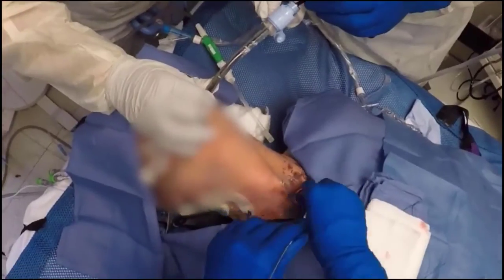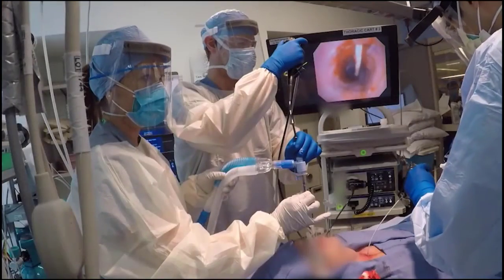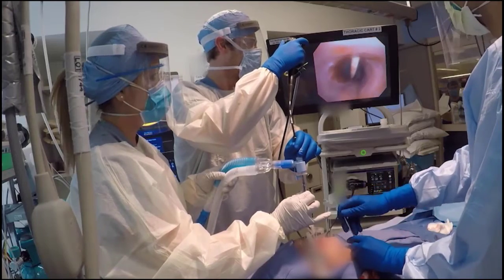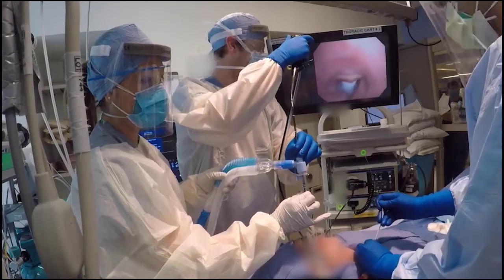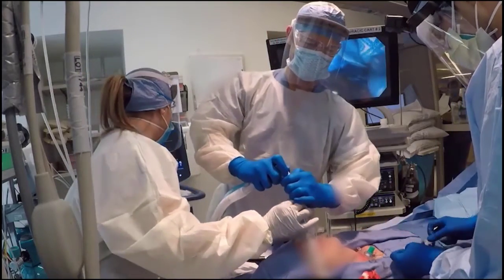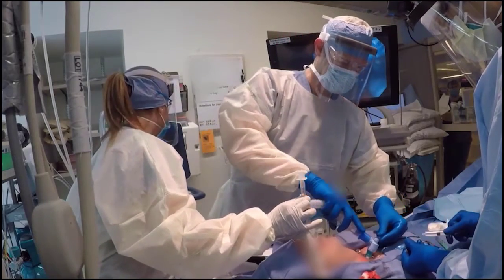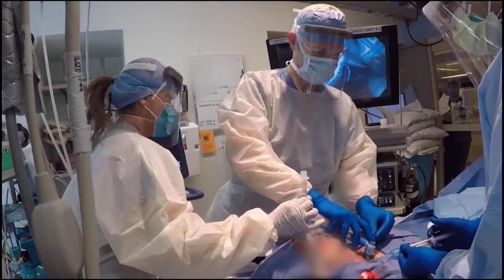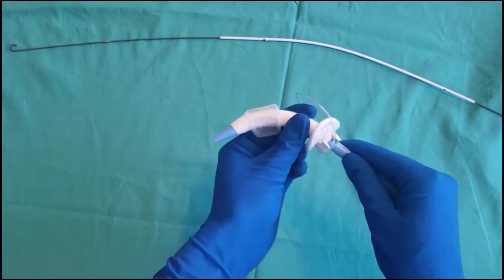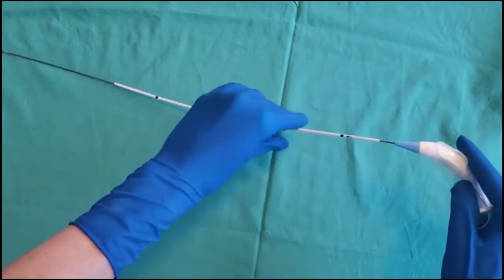Then, insert an appropriately sized tracheostomy tube directly into the trachea over the wire and protective sheath. If using a flexible tracheostomy tube, insert the tube with the curve directed toward the patient's head. Once you visualize the tube in the patient's trachea, rotate the tube 180 degrees to its normal orientation. This prevents the tube from creating a pre-tracheal plane. Alternatively, a non-flexible tracheostomy tube can be loaded onto an insertion trocar and advanced over the wire and protective sheath into the trachea.